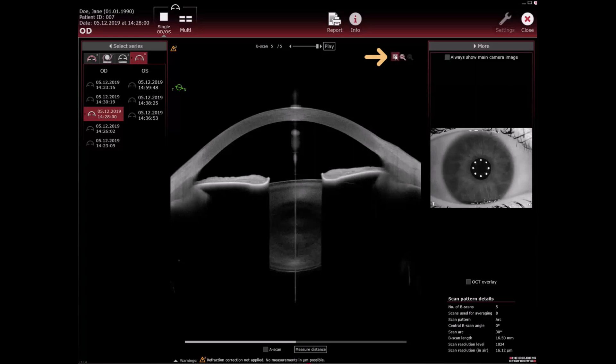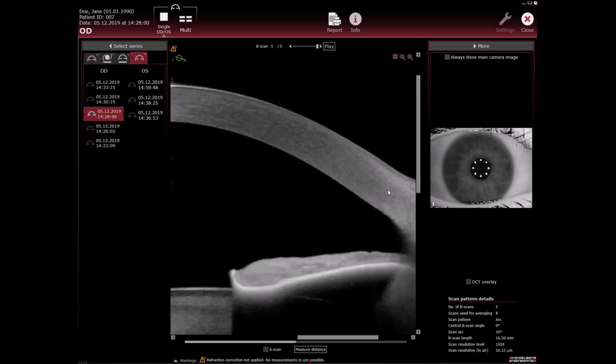Then hold down the left mouse button and draw a square on the OCT section image. To incrementally zoom in or out of the OCT section image, press control and scroll the mouse wheel.